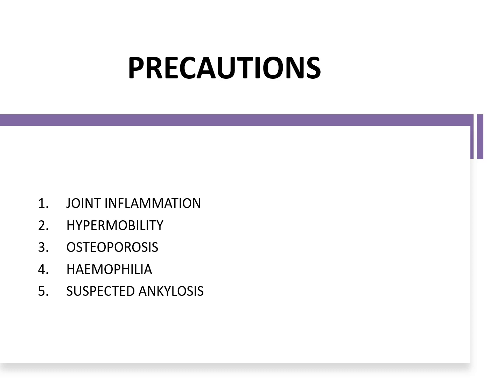Hemophilia, which is a bleeding disorder. So basically, you should be careful that you are not supposed to cause any injury to the patient, because this is a bleeding disorder and the patient may not be very comfortable if he has hemophilia and your goniometry is not very careful and your instrument is very sharp. So you need to be careful in your technique in such patients.